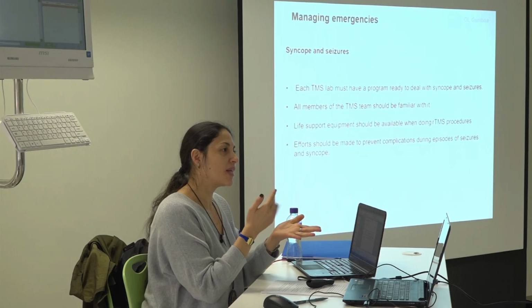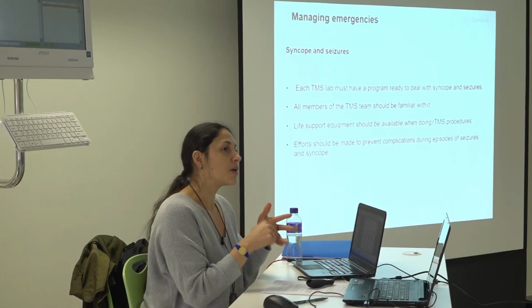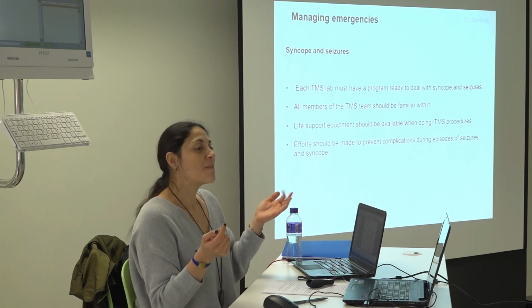I then read the consensus. It was, I think, the first month I was doing this when I started. And I read the risks and I said, oh my goodness, I shouldn't be doing this because this is a contraindication. If you have been unconscious, if you have had a trauma in the head, you should not be measured with TMS. Did something happen to me? No, really, but I had discomfort for 1 week, and I don't want anyone to have that problem.